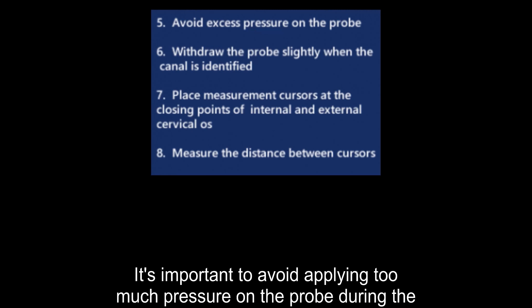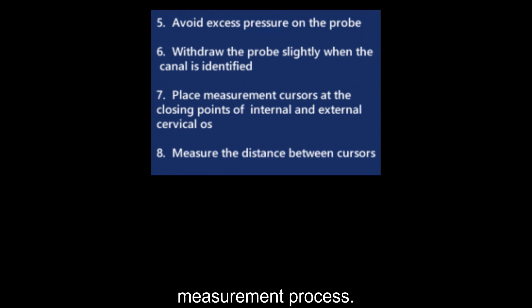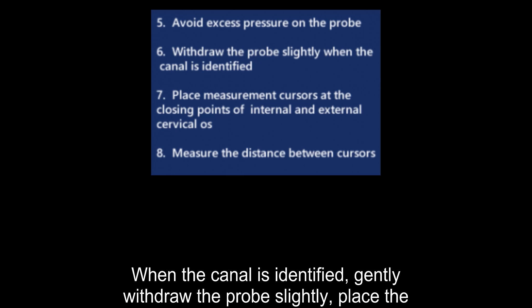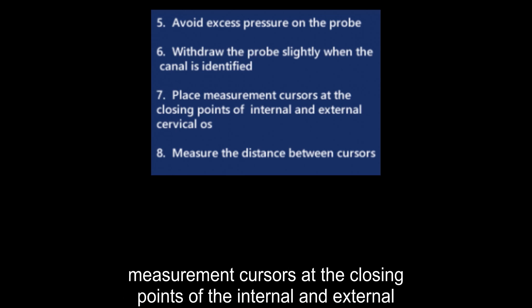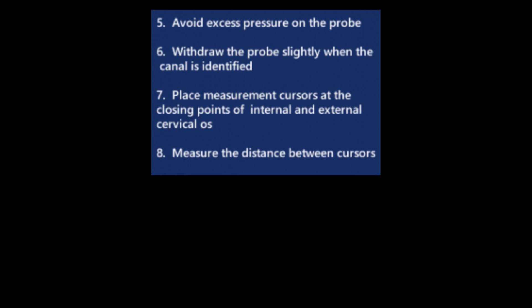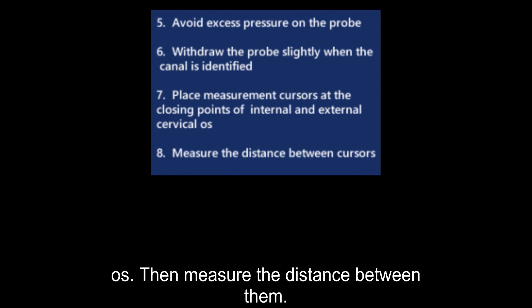It's important to avoid applying too much pressure on the probe during the measurement process. When the canal is identified, gently withdraw the probe slightly. Place the measurement cursors at the closing points of the internal and external os, then measure the distance between them.